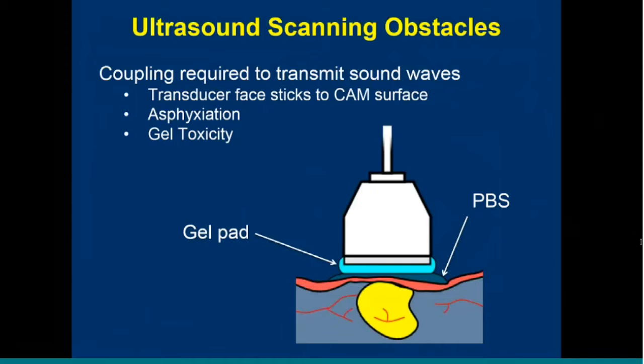So if you are interested in using ultrasound for this type of CAM model or similar model, I want to point out just a couple of the obstacles that we've had to overcome in getting the CAM model to work with ultrasound. And the vast majority of the problems can be summarized in that it's difficult to couple the ultrasound transducer with the CAM in such a way that won't damage the animal.